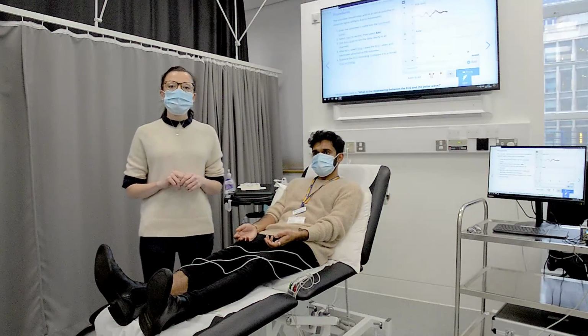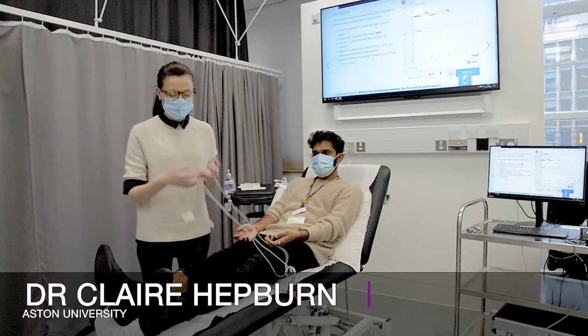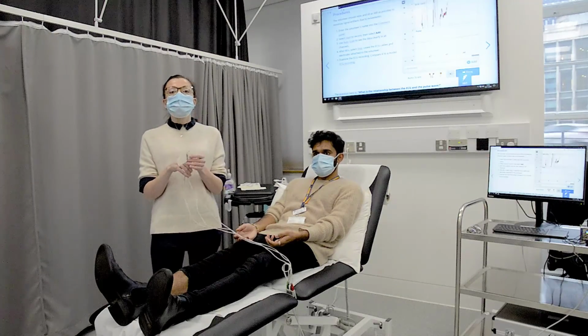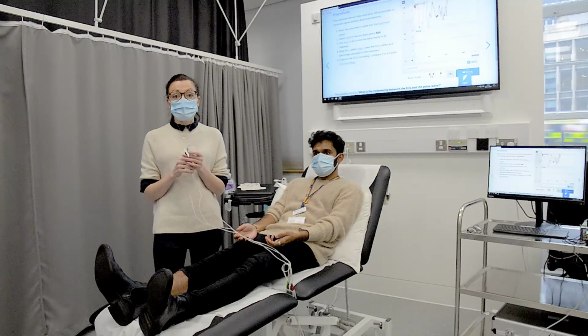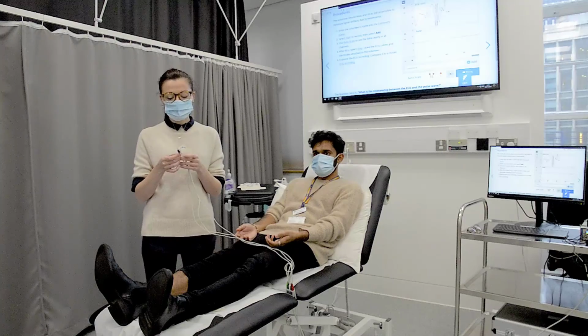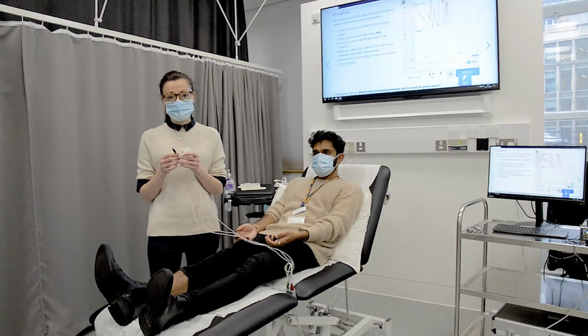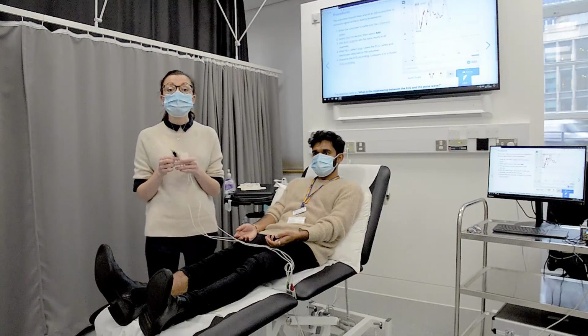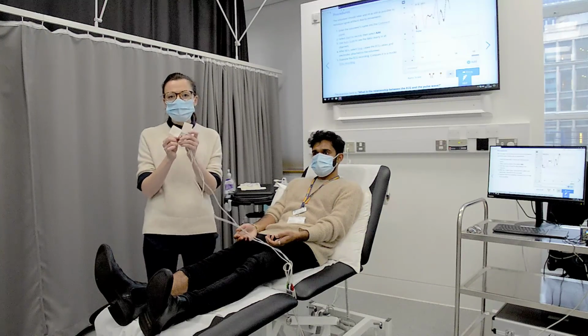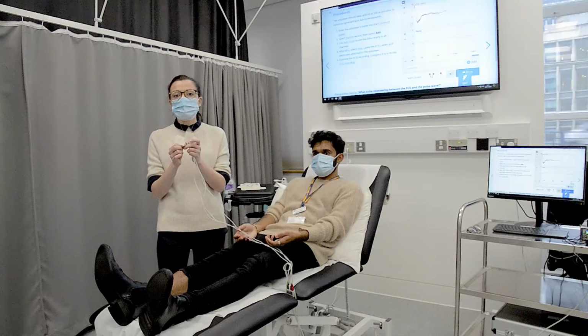Hello, today we're going to be thinking about an ECG and what an ECG allows us to capture. So our heart needs to be stimulated to contract in order to move blood volumes out into our body to meet our metabolic demand. And that stimulus for it to contract occurs electrically. It's called electrical excitation.